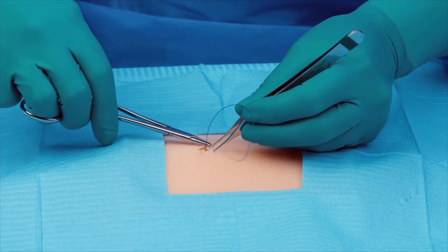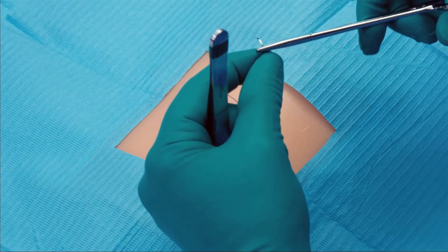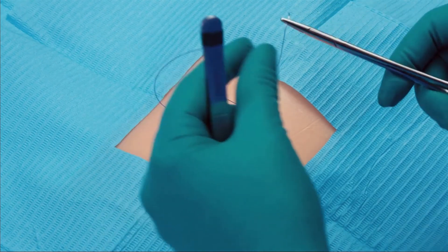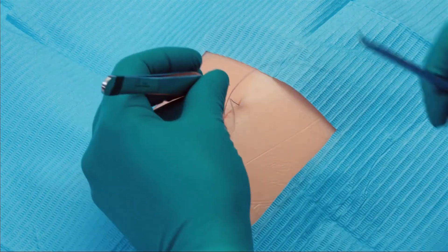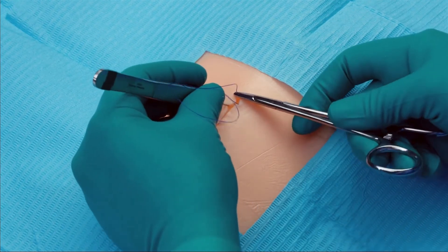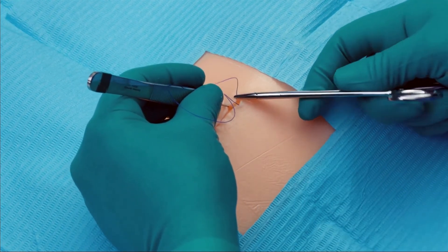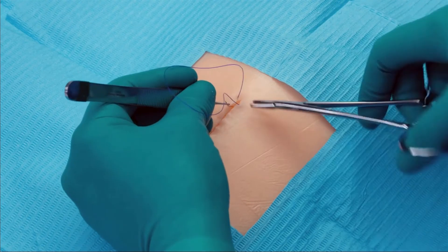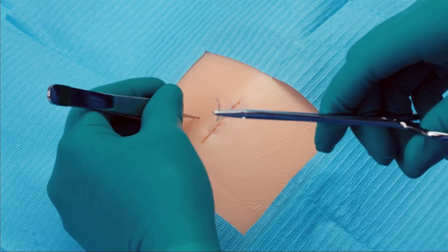Now that the deep dermis is approximated, we can close the superficial layer with the same quill device. In a running subcuticular fashion, take equal bites of the tissue in the horizontal plane of the upper dermis.